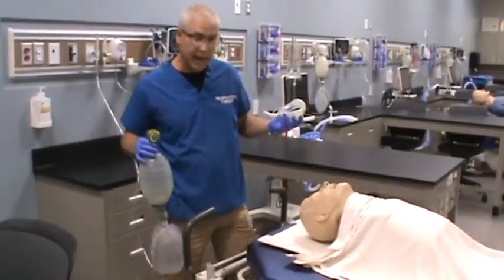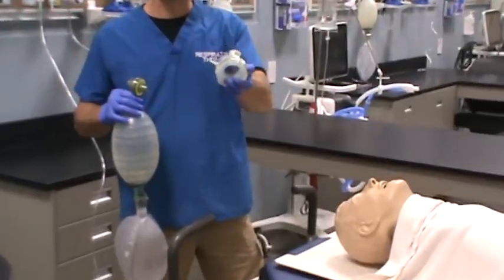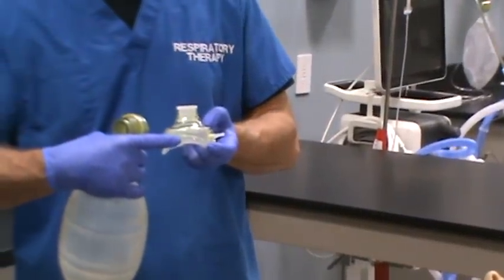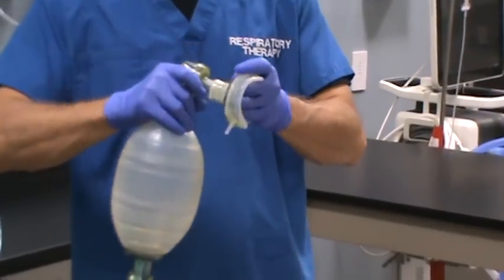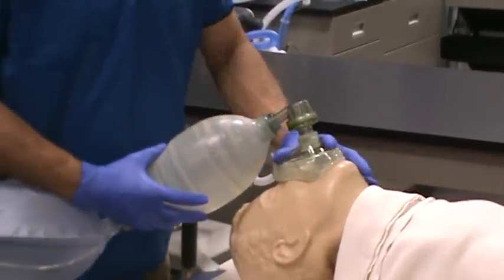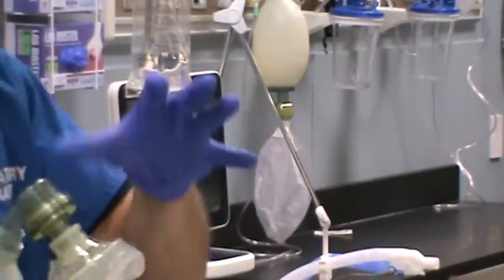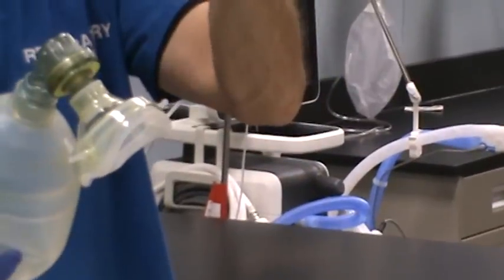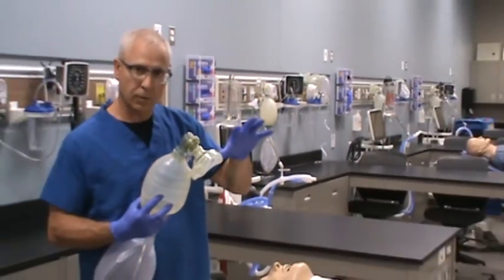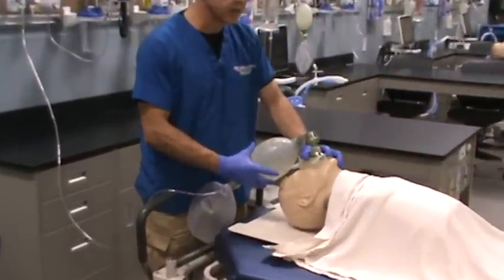Size the mask to the patient — you can tell if it's too big or too small. The top of the mask lies over the patient's nose and bridge of the nose, and the bottom lies between the lower lip and the chin. Attach the mask. Using the EC configuration, place your index finger and thumb on the mask pushing down, while the three fingers forming the 'E' go underneath the patient's chin pulling up — lifting the mandible while pushing the mask down to create a seal.